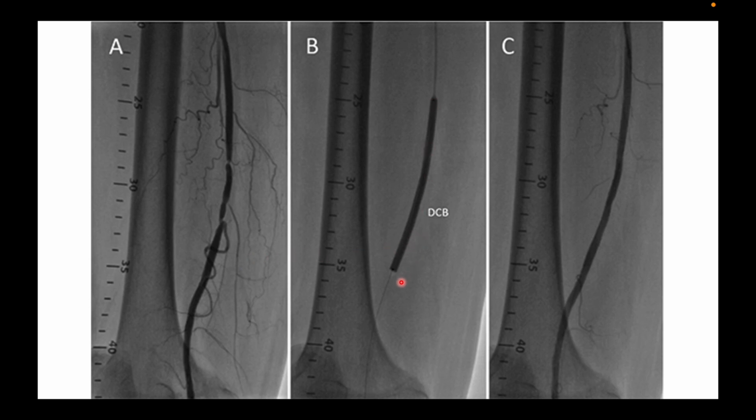So remember, anything below the groin up to the foot is preferably treated with balloon angioplasty alone, or at best drug-coated balloon angioplasty. Cost is a constraint, otherwise drug-coated balloon is a preferable treatment rather than leaving it with POBA alone. And stents are used only for bailout strategies in case of flow limiting dissection, or significant recoil of the lesion with balloon. These are the conditions where you use the stent.